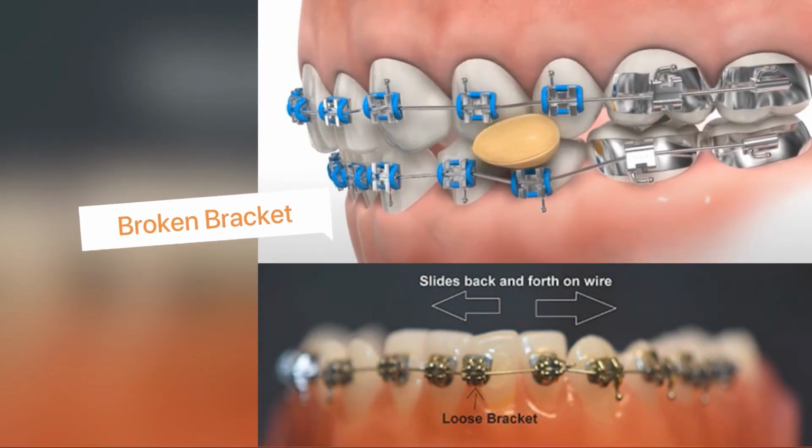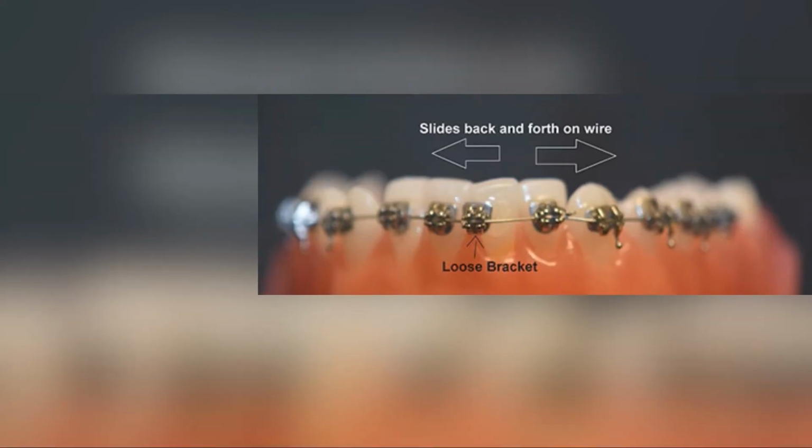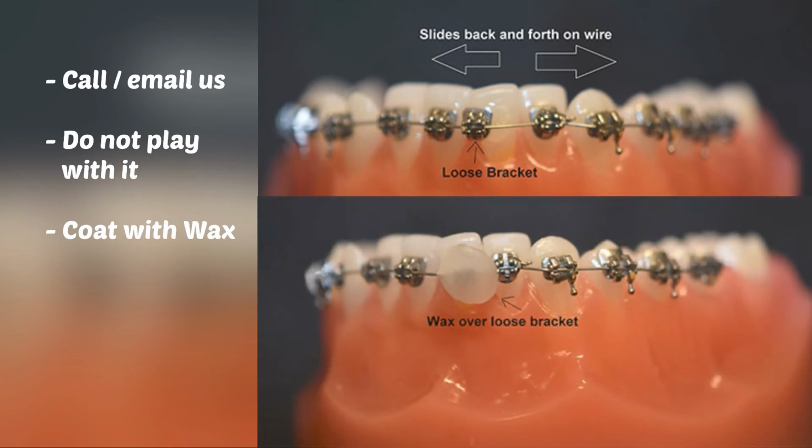A bracket may come loose if you ate something hard or crunchy, and sometimes you may only notice it when you brush and it slides along the wire. You should call us to let us know so we can prepare accordingly for your next appointment. Most times, these won't bother you or give you any pain. Avoid playing with the loose bracket.